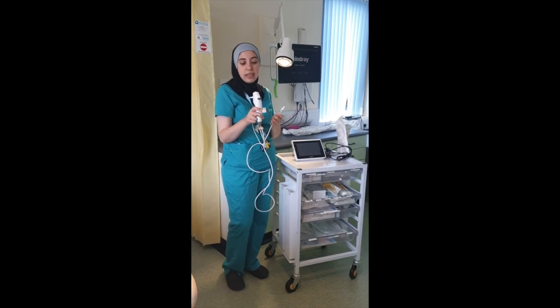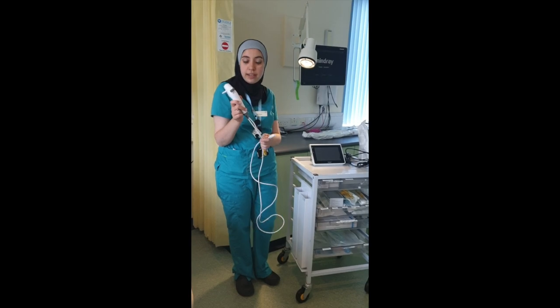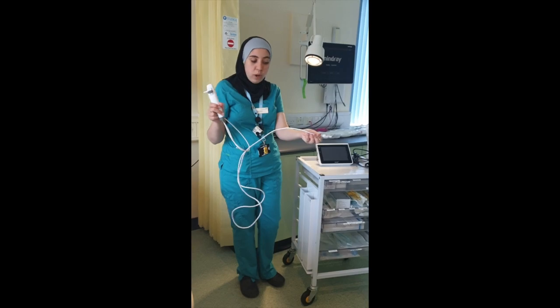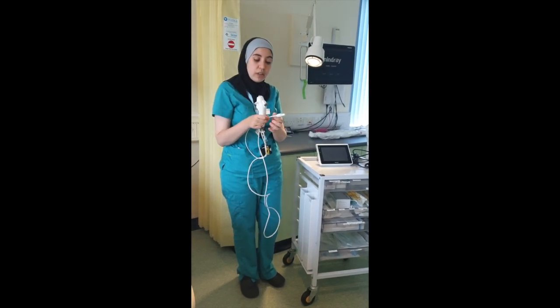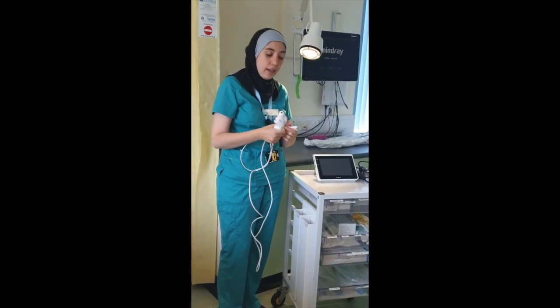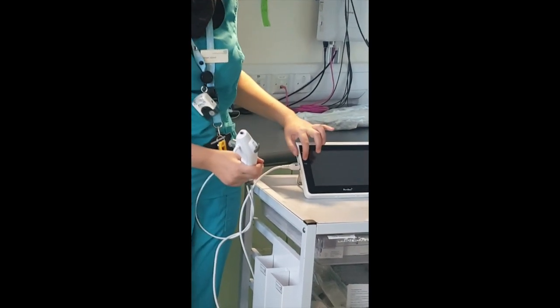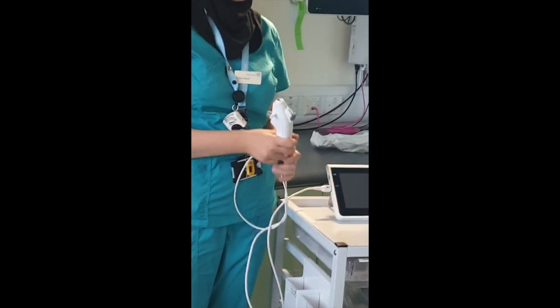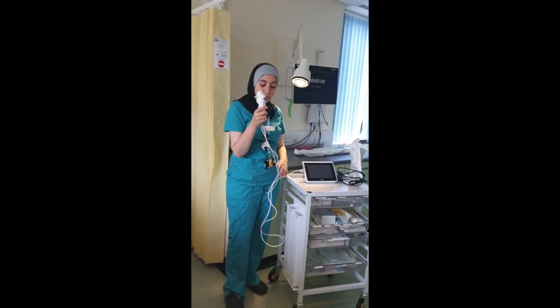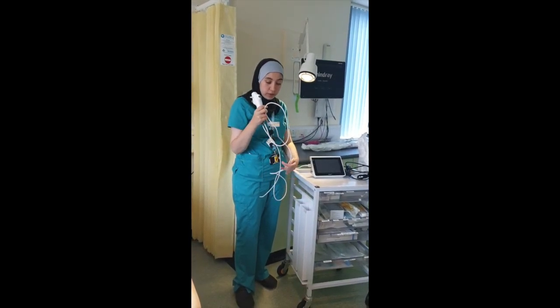As you can see, this is one of the flexible scopes that we've used in the past. It's an ambiscope. It has a wire here which connects to the Ambu screen, and it's color coded. There's a blue arrow here, and that goes into the side of the port onto the blue side, with the blue arrow pointing to the other blue arrow. Once this is connected and the screen is turned on, then you should be able to see a picture, and the light source will come through the screen there.